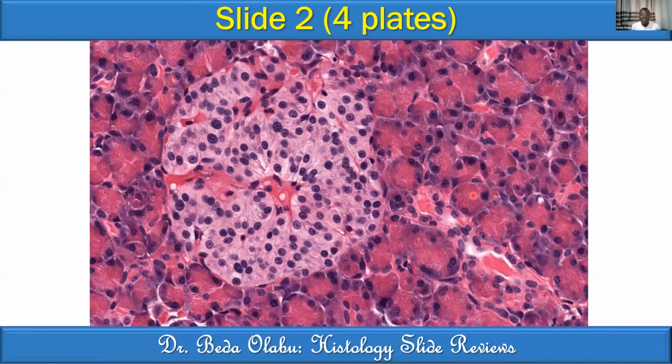And with the description we've given, only one organ will qualify. This is the pancreas. And so these are pancreatic acini, the ones that produce pancreatic juice. We have the acini cells and centroacini cells in that particular element. And remember, the juice is produced into the pancreatic ductal system, and we appreciate the ductal systems on the lower magnification.